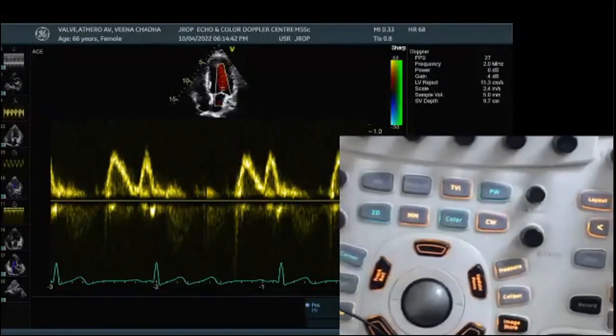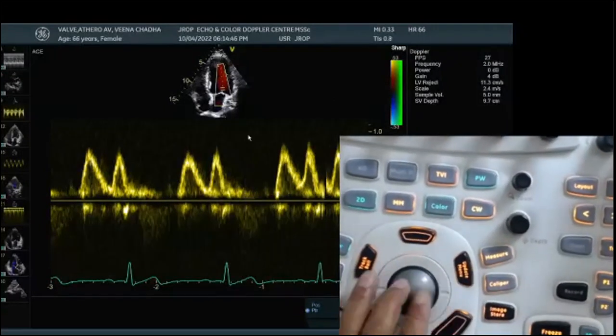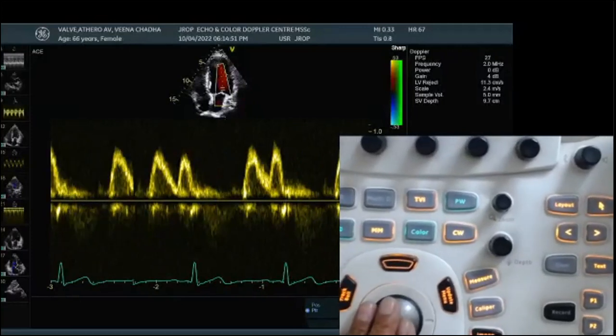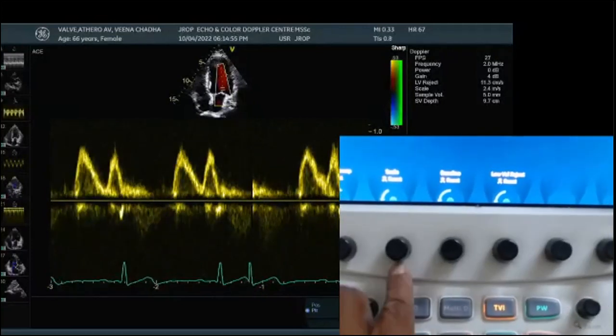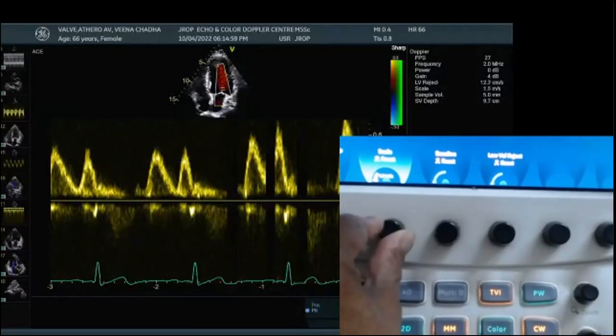Right? Yes, sir. Now look at the right side of the screen over here. This scale is 1 meter. Suppose I reduce this scale. So I'll go to scale reset. There's a button with the name of scale reset. So I'm going to reduce my scale.